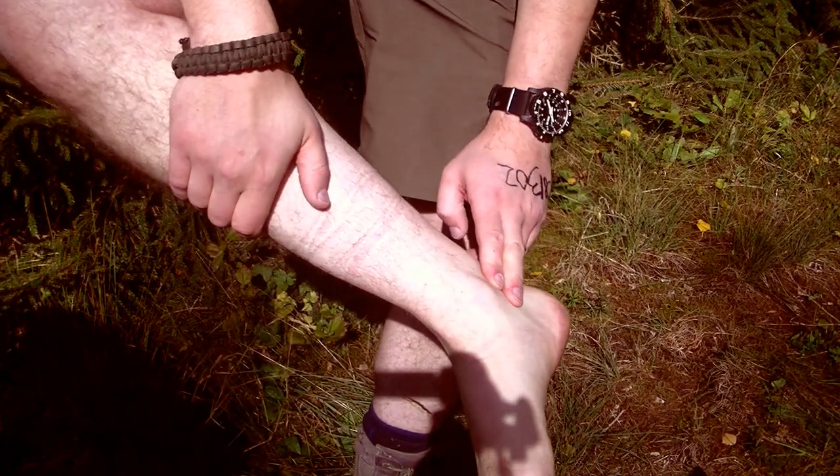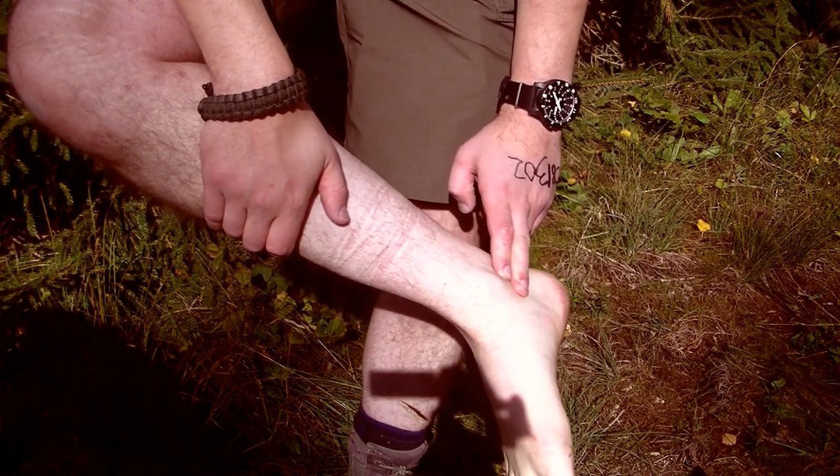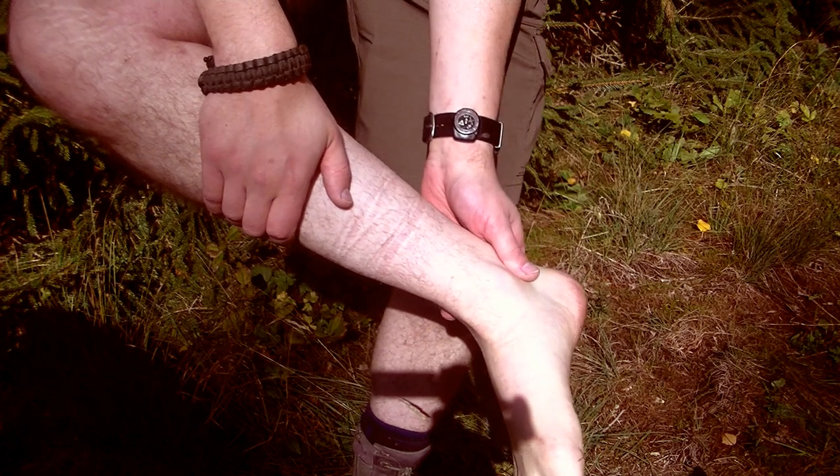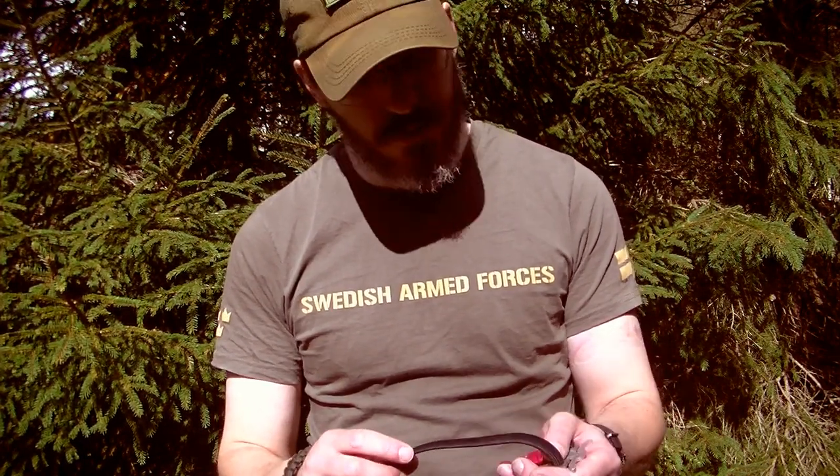The posterior tibial pulse is the most reliable way to check that you have occluded the arterial blood flow when wearing a tourniquet on your leg. That's it for this episode of The Shorts.